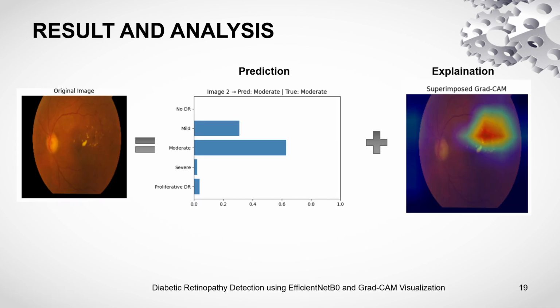Given an original image, my model will tell the confidence score, that is how much it is predicting each class, like what is the class of that image. Based on the confidence score, we'll get to know.